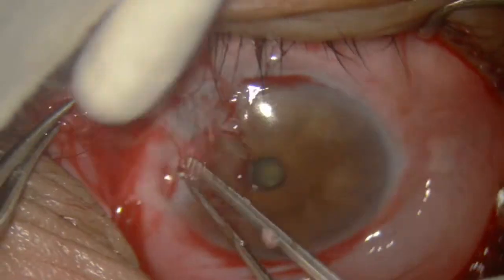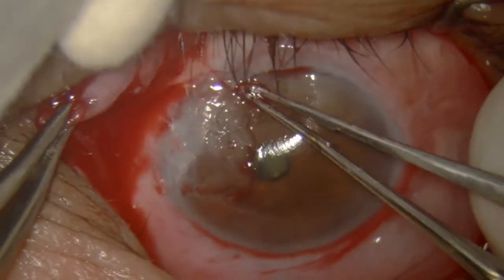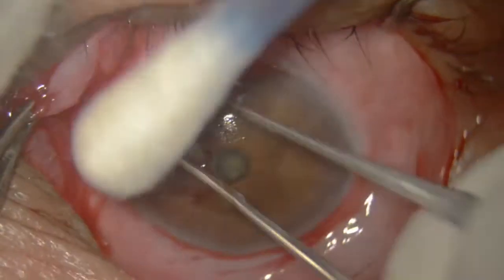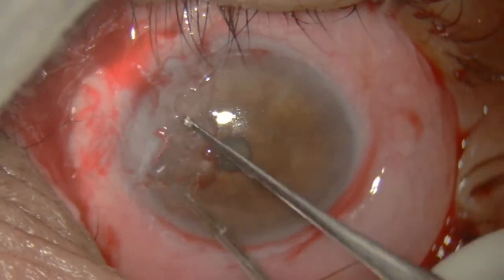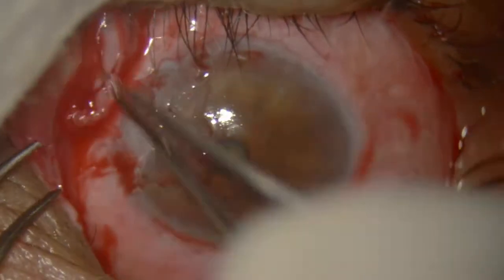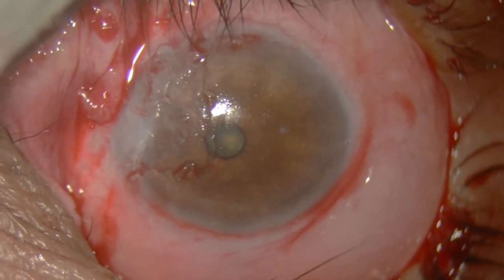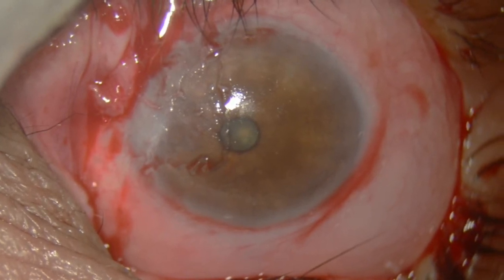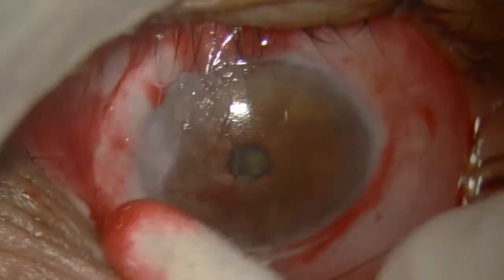If you remove it, then where will you get new flesh to replace it? There is no need for that. You can use this very tissue for covering the scleral area. So what I do is I have cleaned the cornea. The pterygium was peeled off and has been pushed towards the fornix.